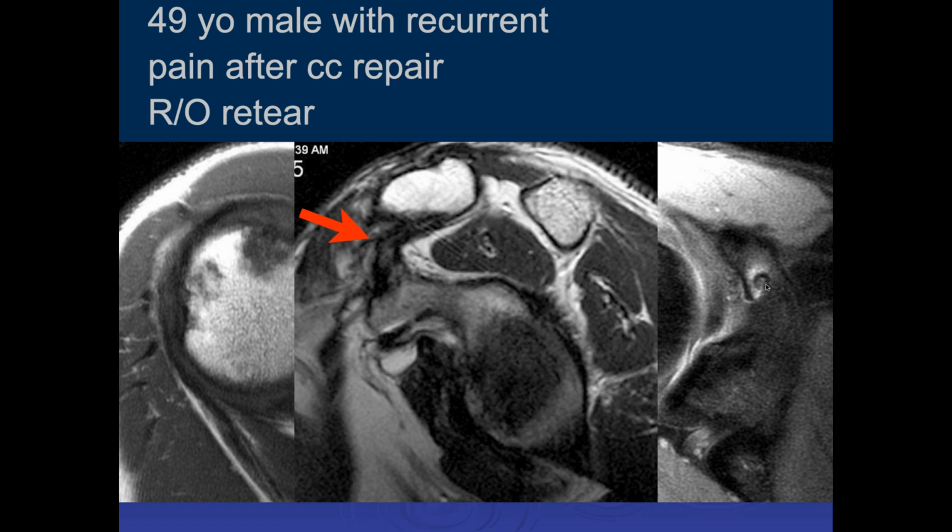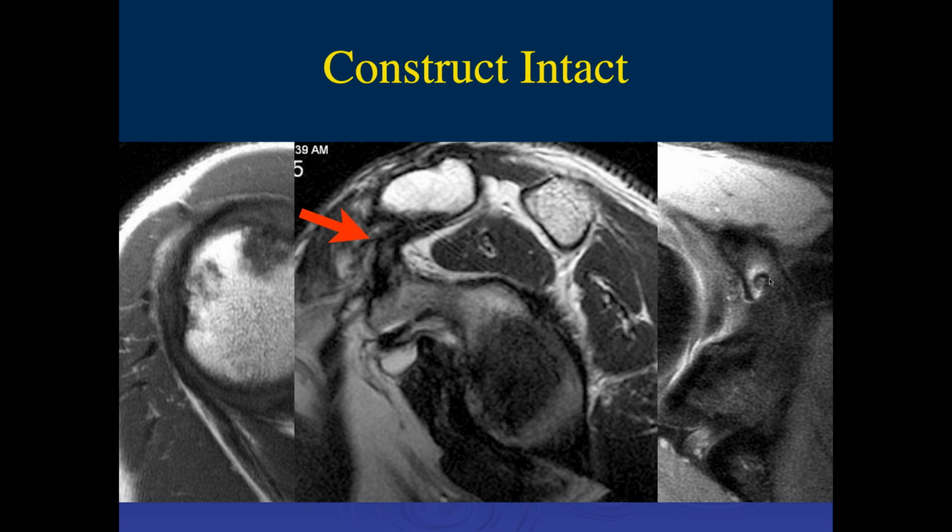The problem is that a lot of these holes are missed when the screw goes in, and then it goes into soft tissue. The patient wakes up, and the dislocation is there again after the anesthetic wears off. Wow. Right. Bad news. That's why I don't like that screw.